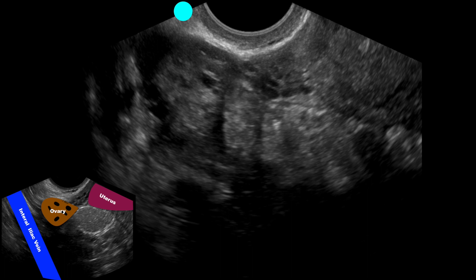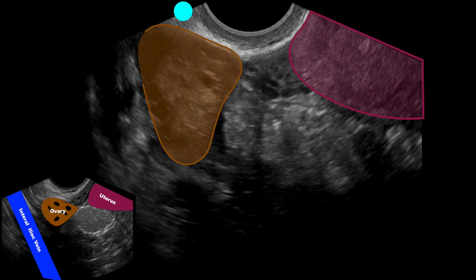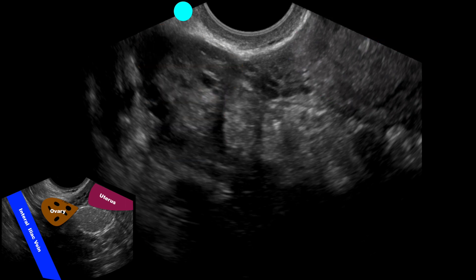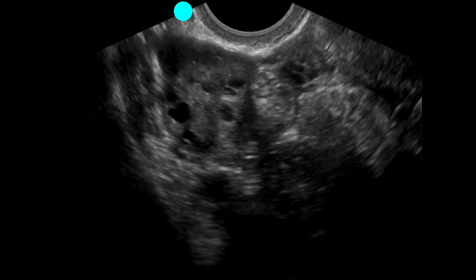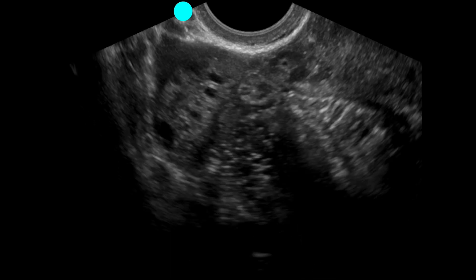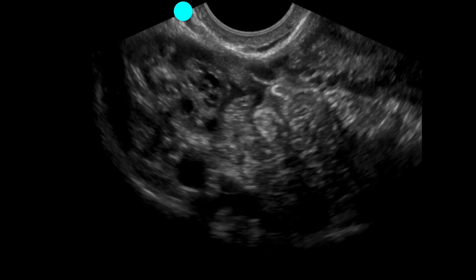We rotate toward the patient's right — our hand actually moves toward the patient's left, but our probe looks into the right adnexa. We have the uterus still in plane, and we also have a structure consistent with the right ovary. Adjacent to it we notice some free fluid. Scanning superiorly to inferiorly to better evaluate this structure, we don't see any cystic structures adjacent to it or anything consistent with an ectopic pregnancy.